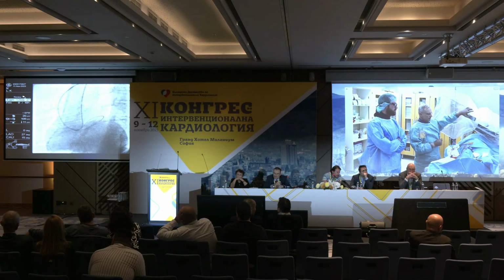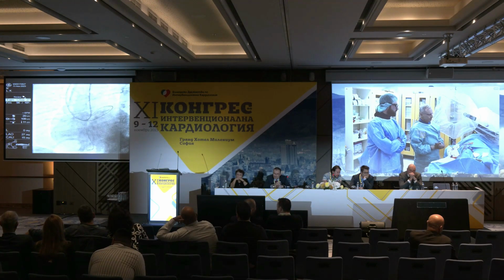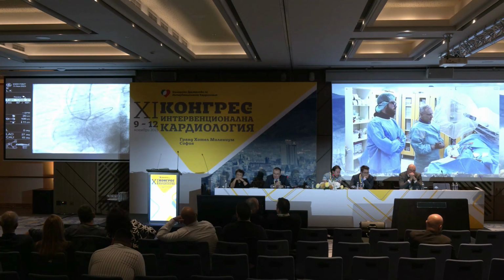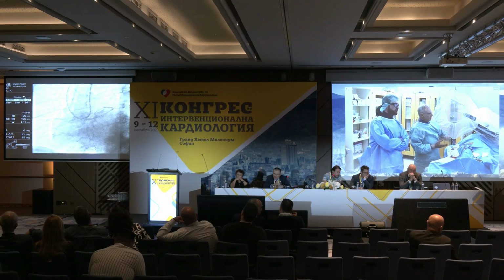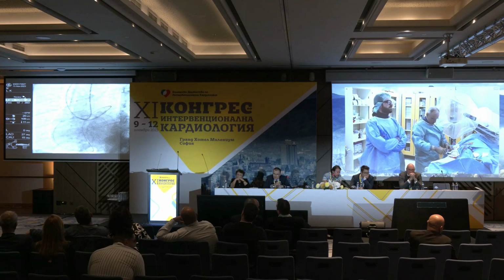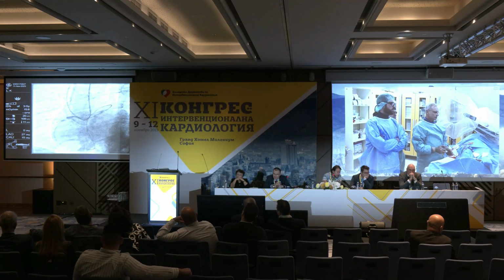Anyway, what happened is that we tried to advance the microcatheter retrogradely, and it makes progress within the CTO, no doubt. You can see it here. And that's where we're sitting now, because the main issue here is that we have the wire in the ascending aorta, but the microcatheter is sitting there.